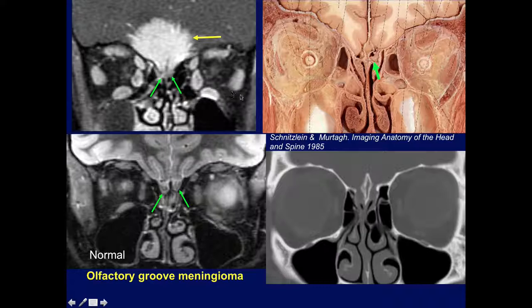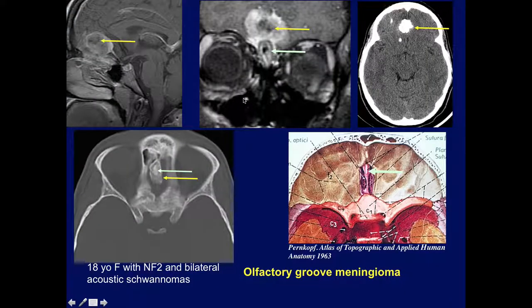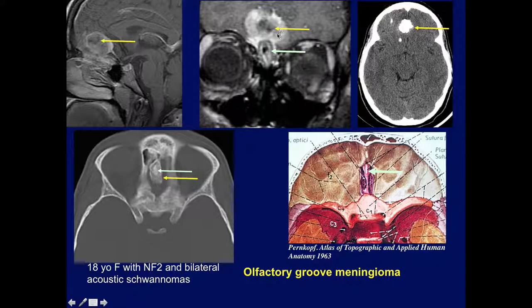The tumor has extended down on either side of the crista galli, which we can vaguely see. Here is a classic calcified olfactory groove meningioma on CT. You can see the crista galli surrounded by the calcified region and the soft tissue part of the meningioma. On MR, we see the entire cribriform plate meningioma with a calcification in the center showing low signal.